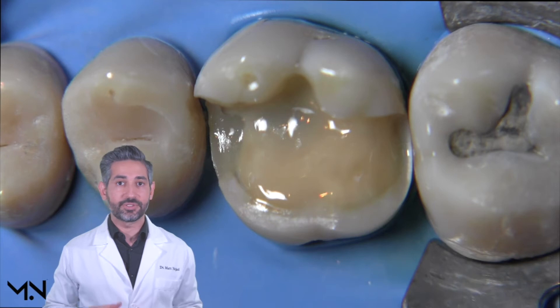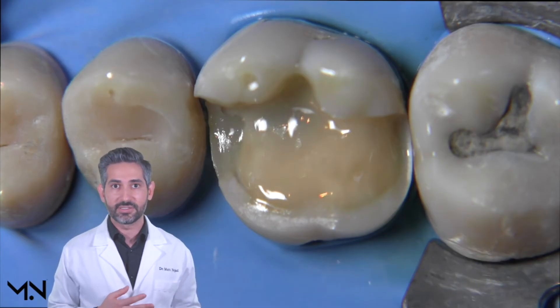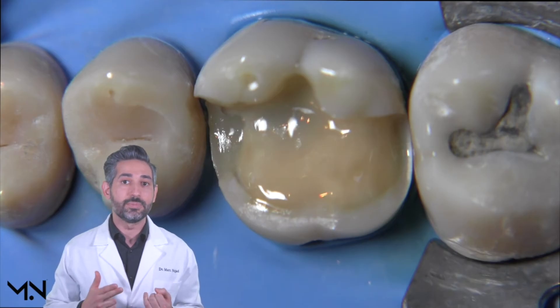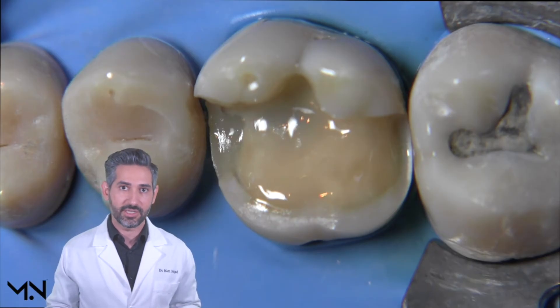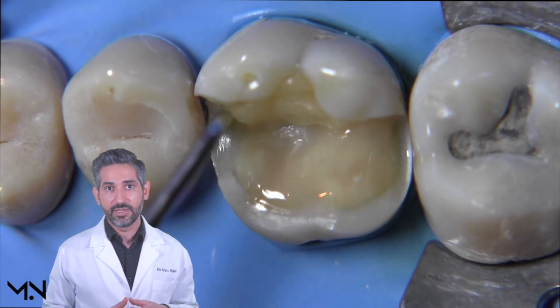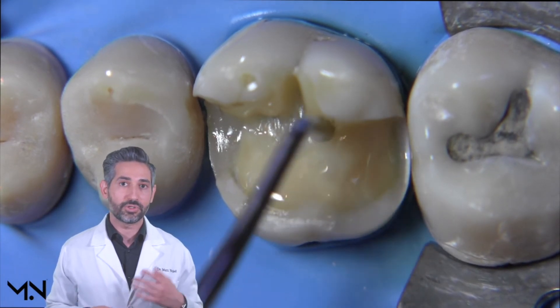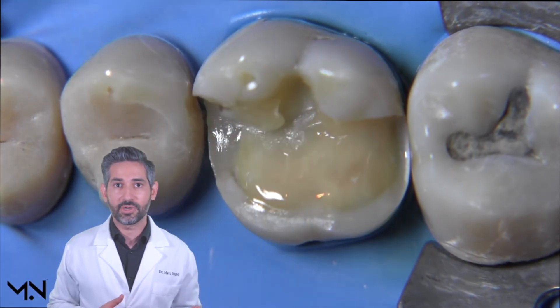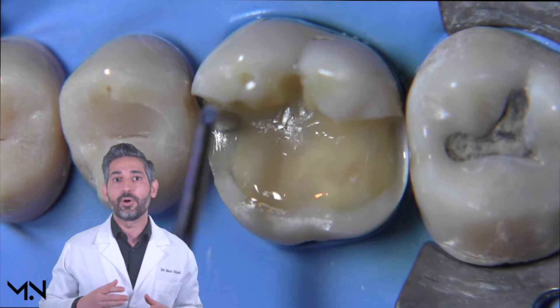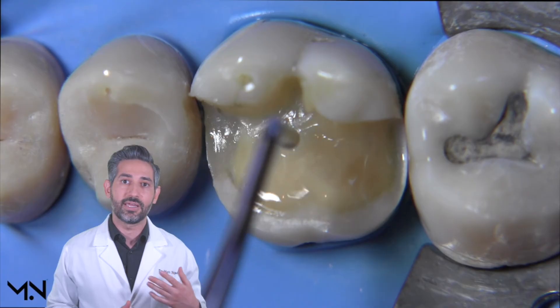Now that we've completed resin coating, the next step is called the bio base — it's almost like doing a buildup, but the idea is to change the shape and deal with problem areas. This includes undercut areas, deep areas that would make it hard to cure our final restoration, or deep margins that we could elevate with the deep margin elevation technique. In this particular preparation, the only area to address is on the buccal where the enamel is undercut. Instead of removing this enamel, we can block the undercut with composite, which gives support to the enamel. Unsupported enamel traditionally had to be removed, but with the biomimetic approach, composite resin gives the enamel the support it needs so we don't have to remove more tooth structure.